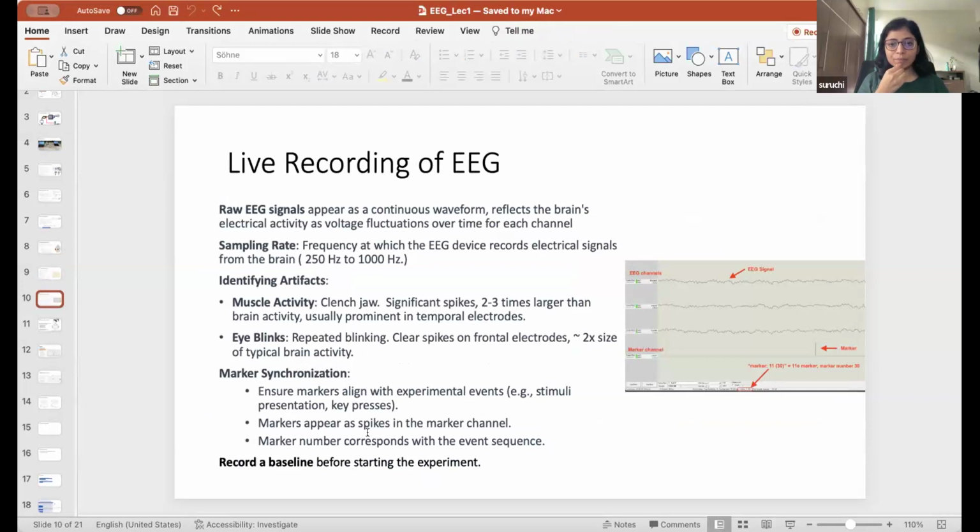Okay, this part both of you have seen. When you are recording EEG, what you're getting, like I told you, is the voltage difference between any electrode minus the reference electrode. The ground gets cancelled out. So you're getting that for all the electrodes. And what you're measuring is generally in microvolts, right? Micro means 10 to the power minus 6. Generally in our household things, it's 220 volts, and then what you're getting is micro, so 10 to the power minus 6 volts. That's after amplifying. So that's what you will see here on the left side when you have an EEG recording. On the left side, your units are microvolts.